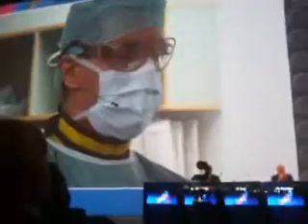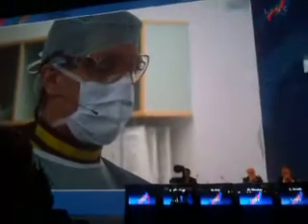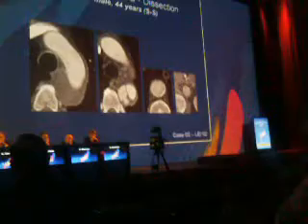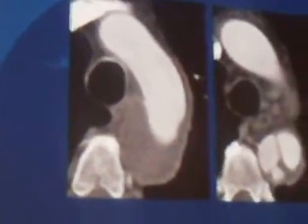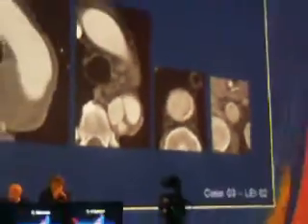So hopefully if you can get back once again to the CT, it appears to be not a too complex case. You can really see the dissection here starts around the left subclavian artery, so that's typical. Then we have an entry, let's say 2-3 centimeters more distal, at least on the CT. The true lumen is usually the very narrow one in the distal thoracic area, and what is new now with this patient is the claudication on the right side.